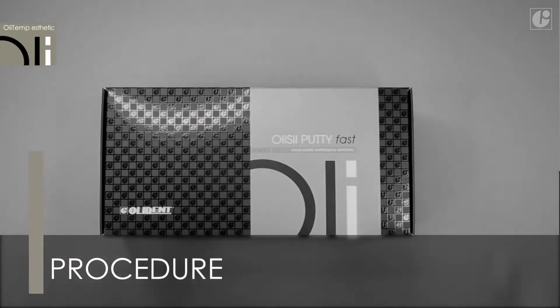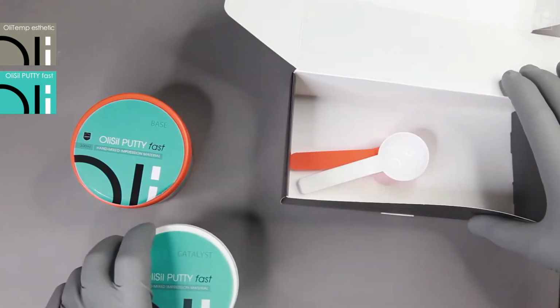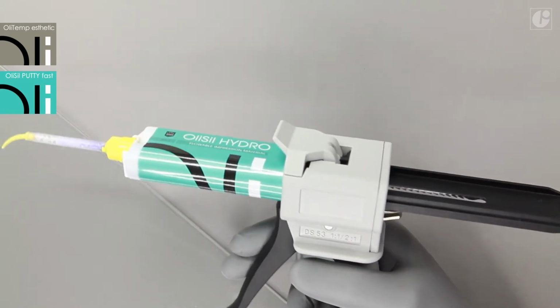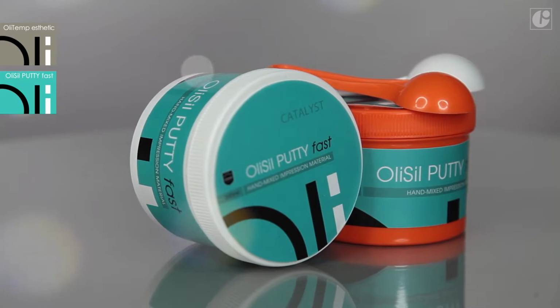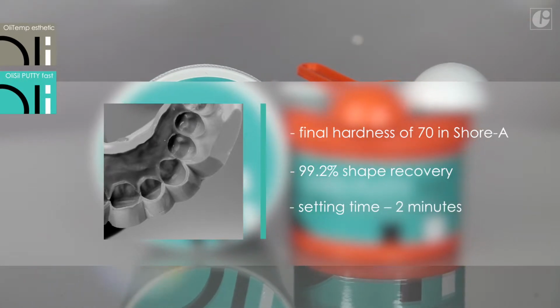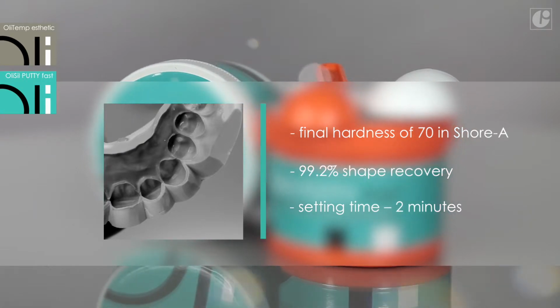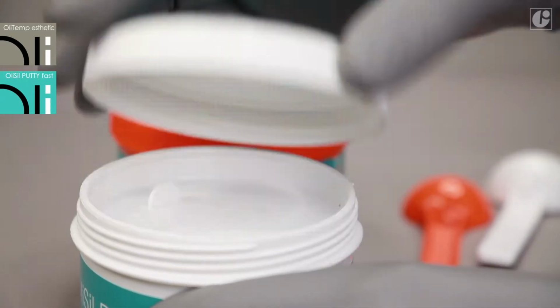The first stage involves preparing a silicone index that will serve as a matrix for the temporary restoration. OliSil Putty Fast and OliSil Hydro were used here. OliSil Putty Fast is a fast-setting silicone impression material intended for hand mixing. The material's Shore-A hardness of 70 and 99% shape recovery enable the preparation of highly precise temporary restorations. The short setting time is undoubtedly an additional advantage while taking situational impressions.